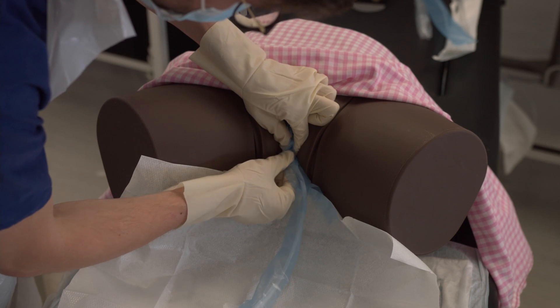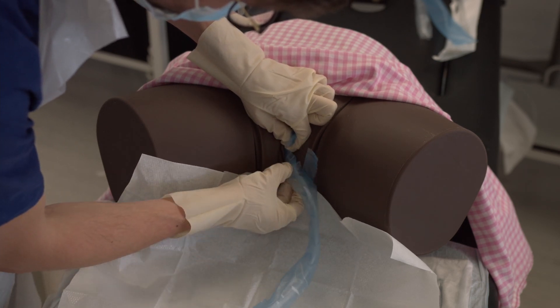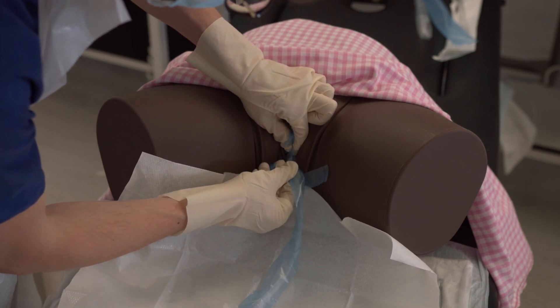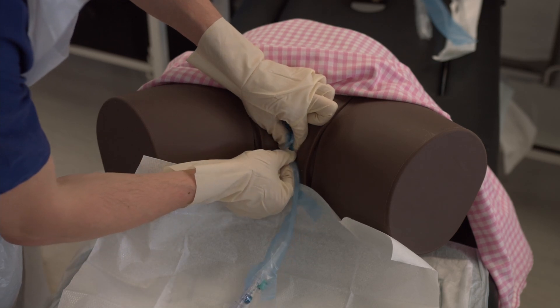At some point in a real patient you would see urine flowing down the catheter. In an exam you may be told you have reached urine. When that happens, insert a further eight to ten centimeters and then inflate the balloon.